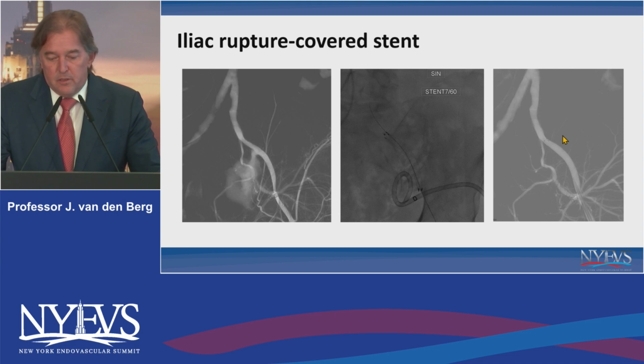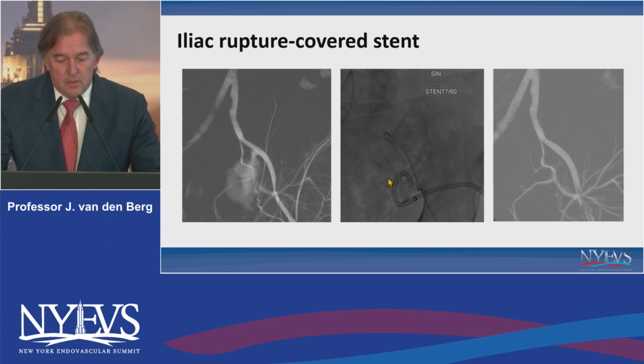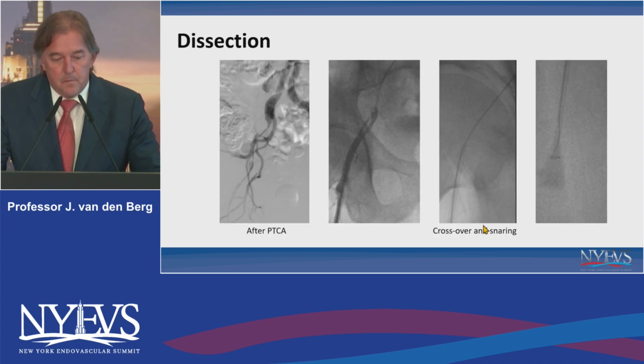That's not really very difficult, and this is actually a complication from an abscess drainage coming in from another hospital. You can see the drain in situ, and this patient was also treated with a covered stent.